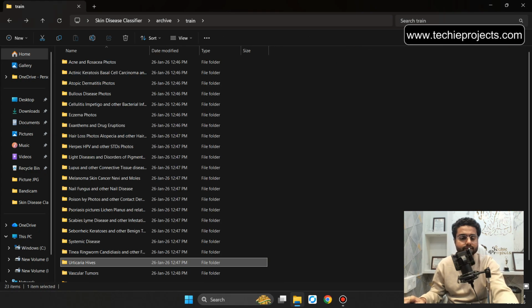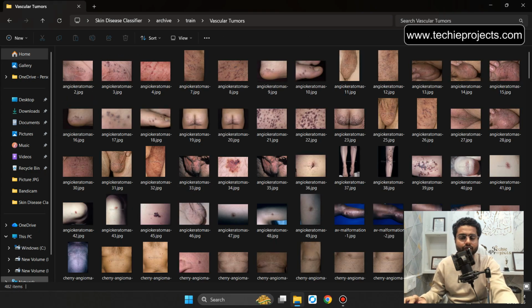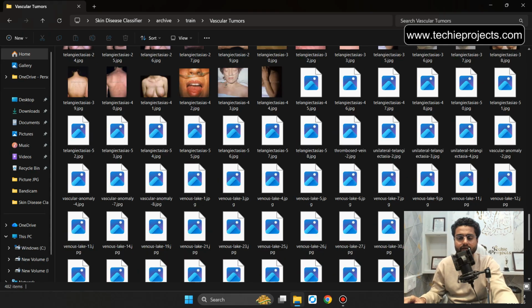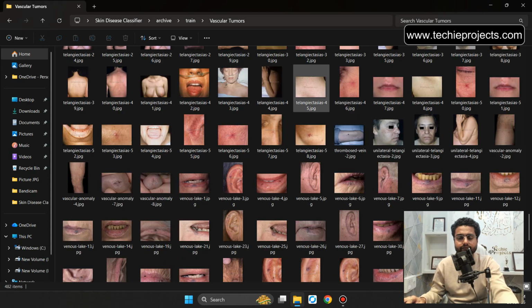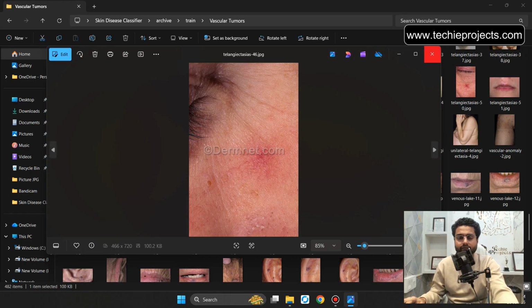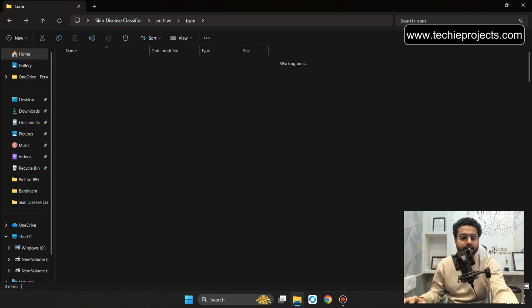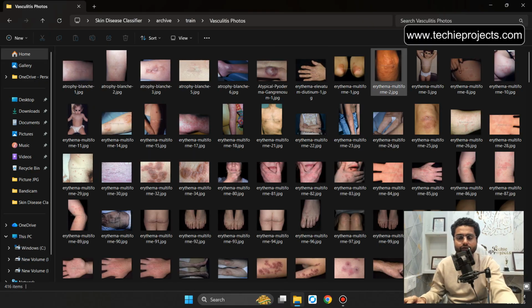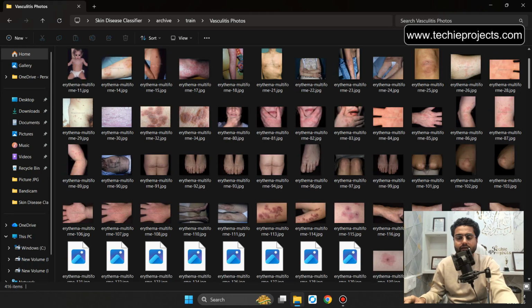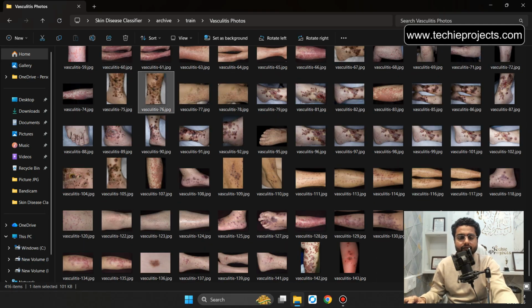Let's go back. Now the vascular tumors. It will be around 482 items. Let's open any of the images. It looks like that. Let's go back. Now the vasculitis photos. It will be around 416 images. Let's scroll down. So it looks like that. Let's open any of the images.